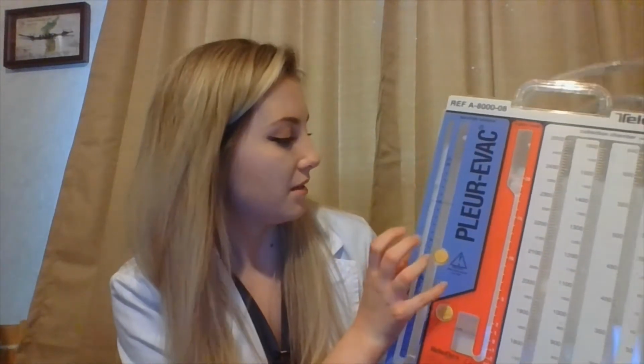So then you have the suction control chamber in blue over here. So suction is regulated by the height of the water in the suction control chamber when connected to wall suction. So basically the doctor will give you an order for how much water to put in this part, and then you will fill it up, say to 20 usually. So you will hear and see gentle bubbling in this area while it's working, so don't freak out because this is absolutely normal. So water can evaporate in this chamber, unfortunately, so it is very important to constantly monitor this and make sure that it's staying at the level that is prescribed.